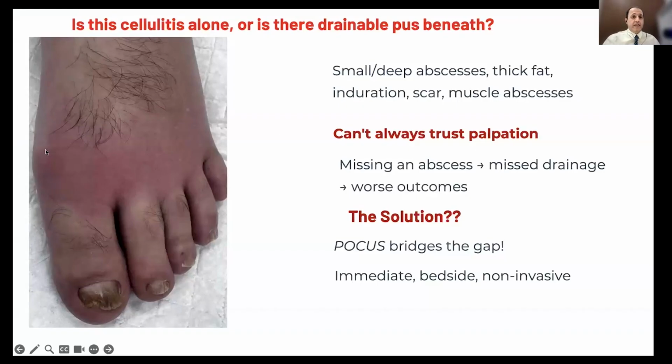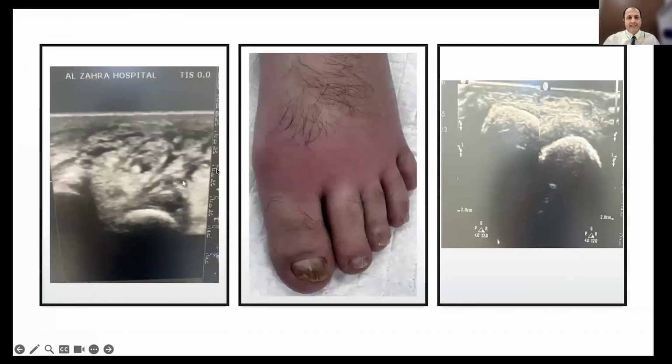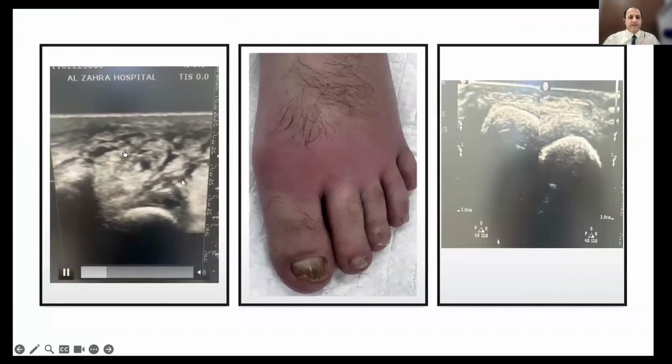This picture that you see is one of my patients I saw a few days ago in the emergency room. He came with just a little redness, warmth, and a little discomfort, but not true pain. The patient was on tramadol and antibiotics for another reason. So it looked like cellulitis to me. By default, I went to perform the POCUS for this case, and I found something very unexpected. This is the clip of that ultrasound.